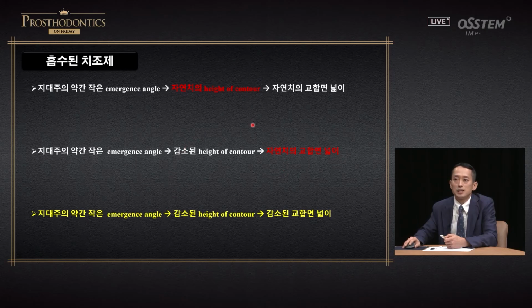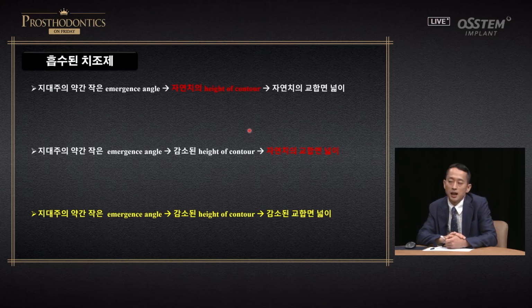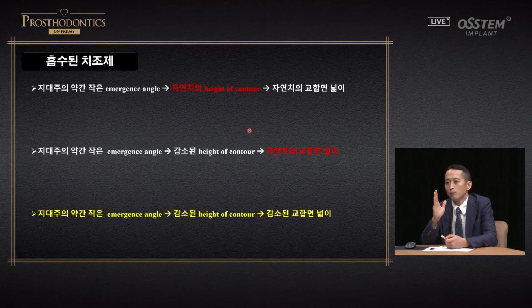The problem with that abutment is how are you going to design the contour of prosthesis and occlusal table? That is the key. You need to consider various variables as shown and choose one with comparatively less problem.